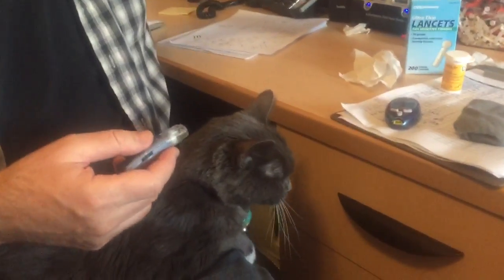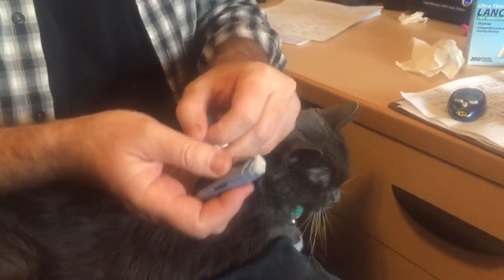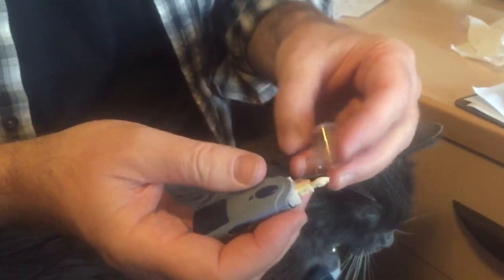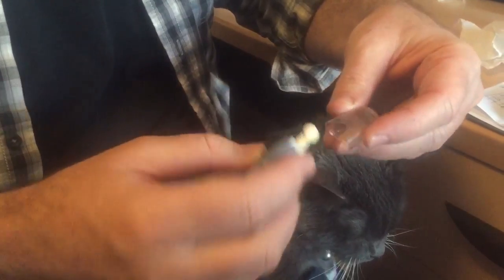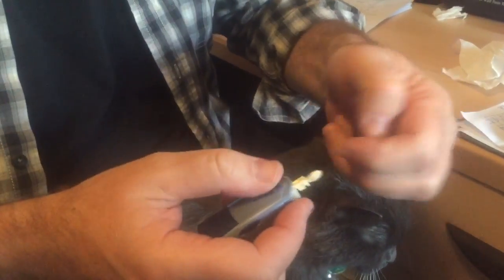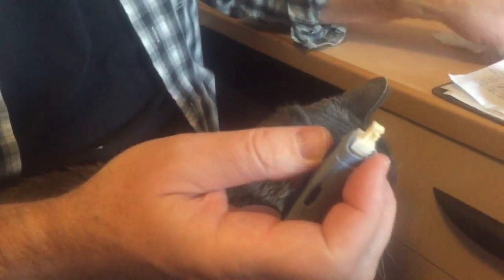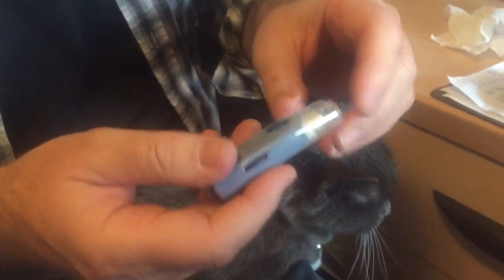First thing, you get one of the lancets out and open this up and just shove it in there — be careful, it's pokey. When you put it back on, make sure the little shape matches on the right side; it won't go on both sides. You've got to take this off first, then you twist it and now you can see a little needle there. Don't poke yourself with that, it hurts. You close that off.